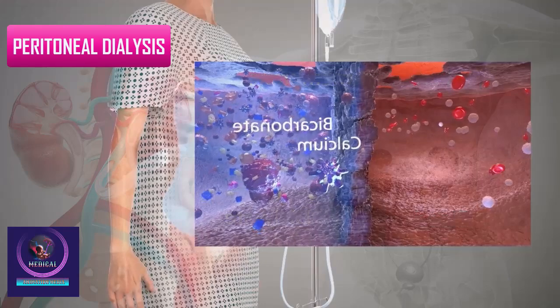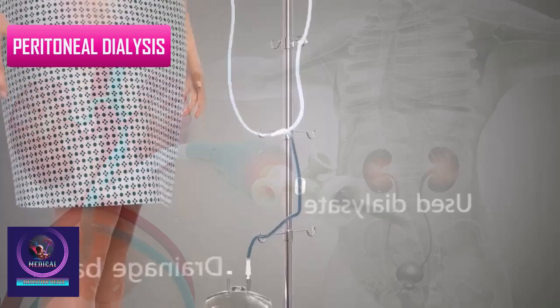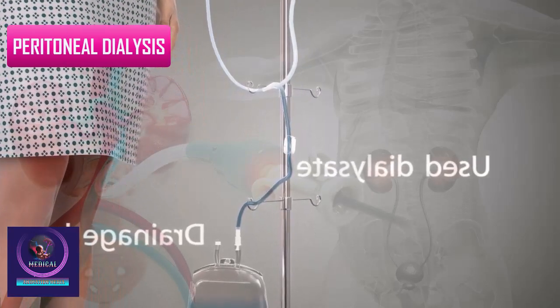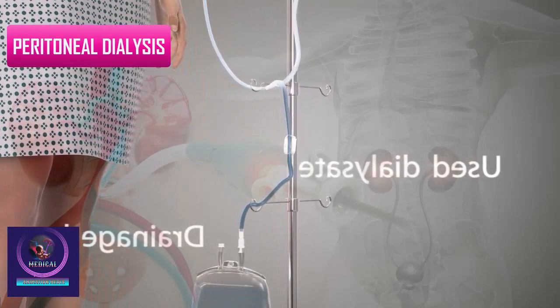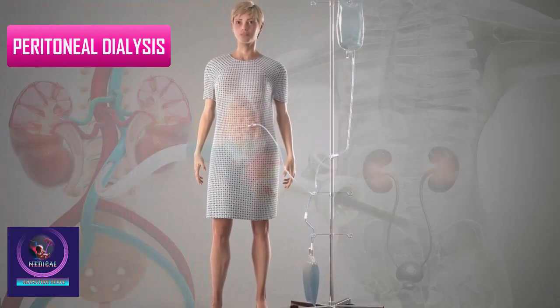and filtration. In the outflow or drain phase, the used dialysate flows out of the body by gravity into a drainage bag. The duration, number, and frequency of peritoneal dialysis exchanges vary with the patient's condition.